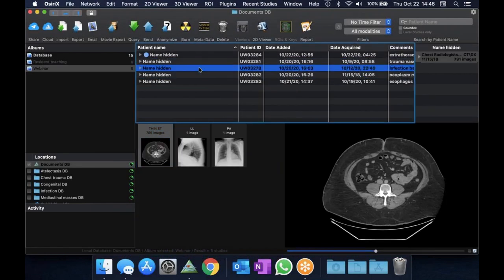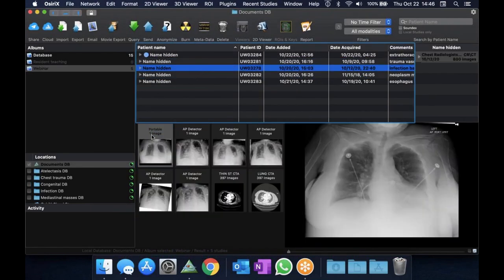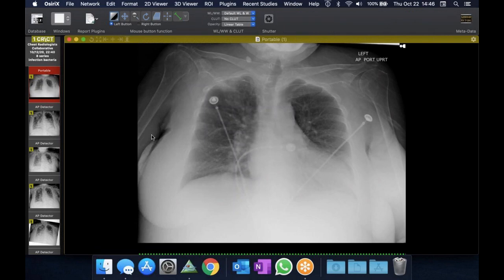Okay, this is a nice example of this infection. This patient presented with cough and fever. And of course, everybody's thinking COVID, but not everything is COVID. This was the initial radiograph done somewhere else. There's some vague consolidation in the left lung, maybe a little bit on the right, and maybe a little bit in the right upper lobe. It could be early COVID, but rather quickly this progressed.